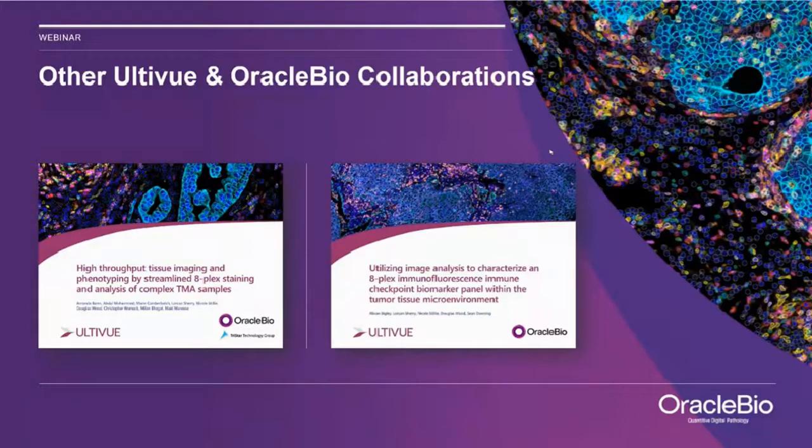For something like a classifier algorithm, this involves performing a dice similarity coefficient evaluation, where we create fields of view across a set of the study images, and our pathologist annotates the tumor stroma present, which represents the ground truth, while our image analysis scientist independently analyzes the field of view with the classifier that was developed for the tumor stroma segmentation. And then the content of the area per ROI from each of those approaches is calculated as a dice score, using the dice equation, and a value of greater than 0.9 signifies good correlation between the pathologist and the algorithm.